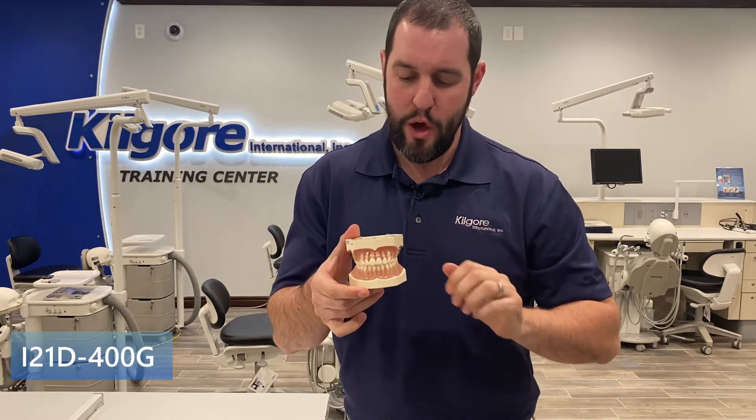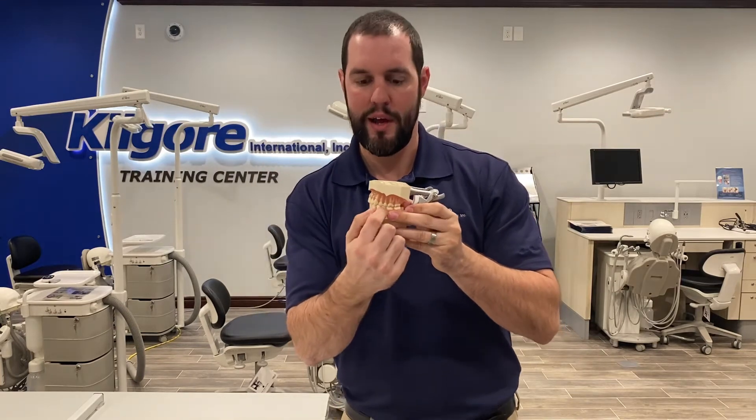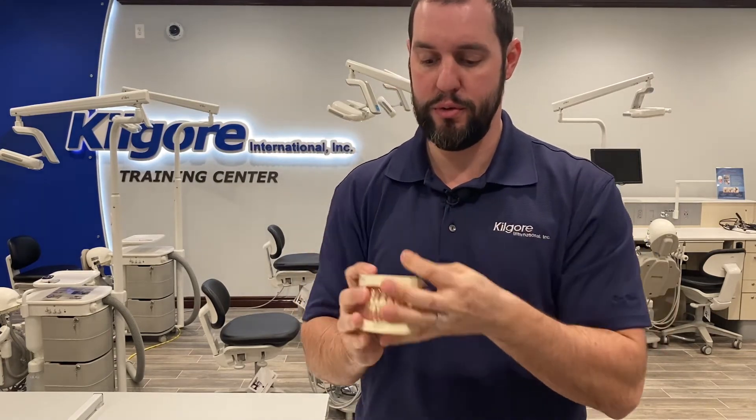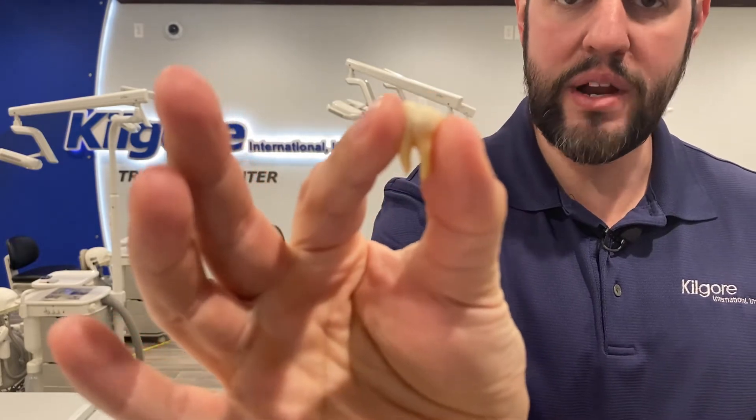The I-21D-400G model is one of the most popular models we have for anatomy. What I love about this model: you have superior crown and root anatomy, two-tone in color to distinguish between the root and the crown. It's great for instrumentation — you can instrument around every single one of these teeth and they're not going to fall out. You can even take a probe down in there to show a student or patient how far a 6mm or 4mm pocket is. The teeth are all friction-held, so I can pull out a tooth and show you the excellent crown anatomy and root anatomy — very detailed.